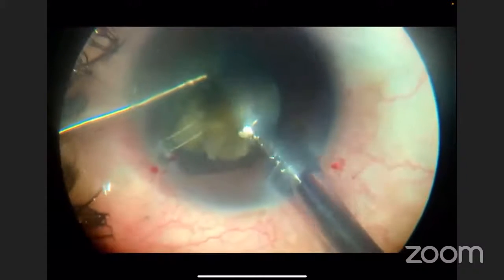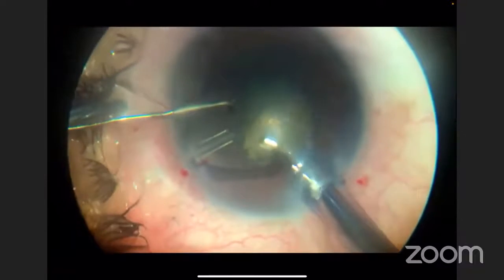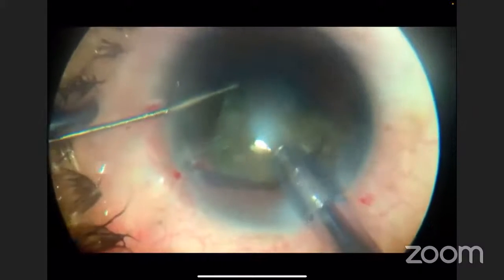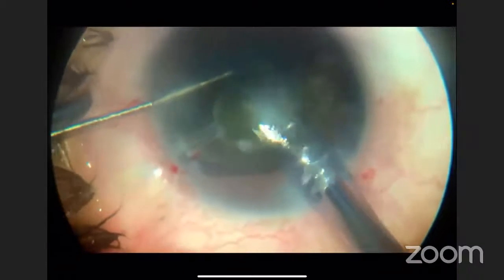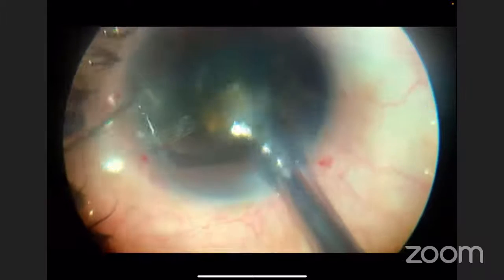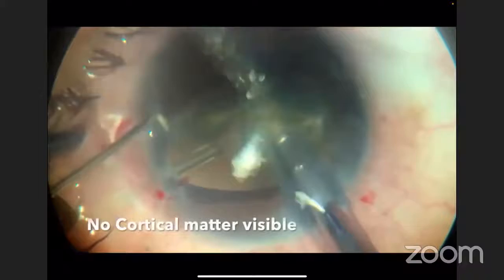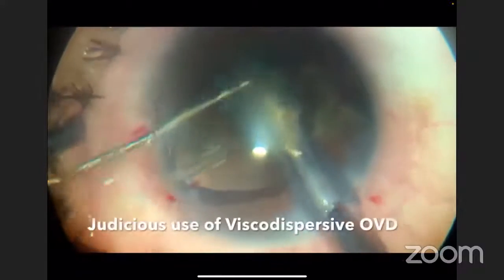So now, gradually the pieces were coming up and there was actually no epinuclear plate which can protect the PC. So I had to change the long chopper to a smaller one in between just to make sure that I don't puncture the PC. And following this, now this is the change of the chopper and the last piece being taken up. You need to reduce your phaco parameters at this juncture. You can see that there is no epinuclear plate or no cortical matter. It was a totally mature cataract.